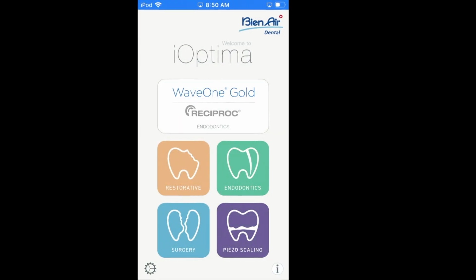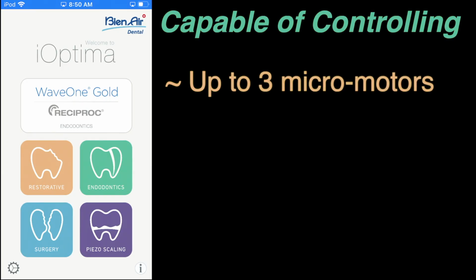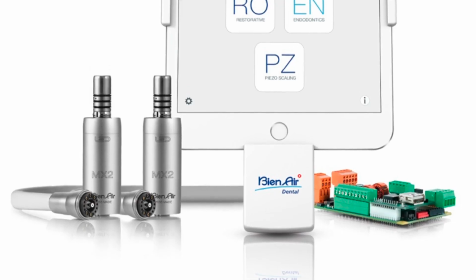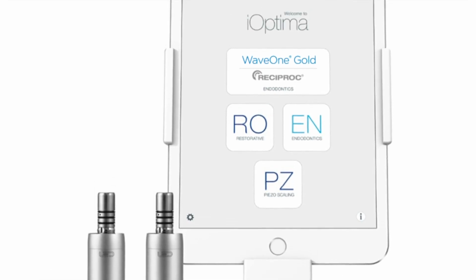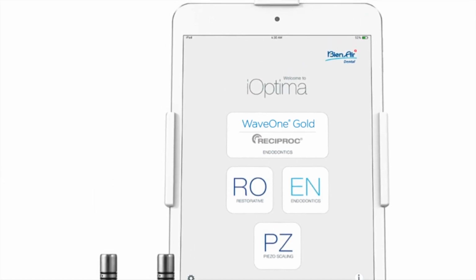The iOptima INT is capable of controlling up to 3 micromotors, a piezo scaler, and a sterile irrigation pump. The system is equipped with a memory recall feature that will recall the last app setting used with any motor to seamlessly transition from high-speed motor to slow-speed motor or endo motor.